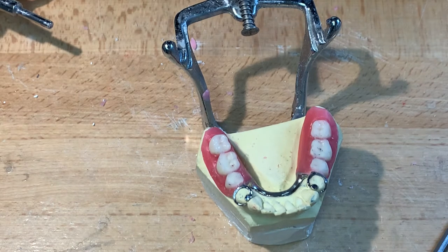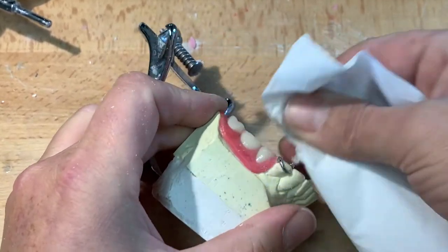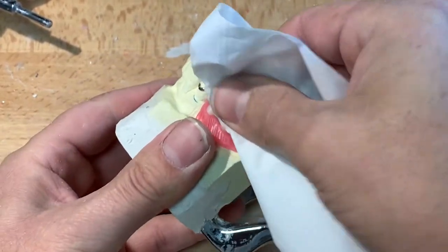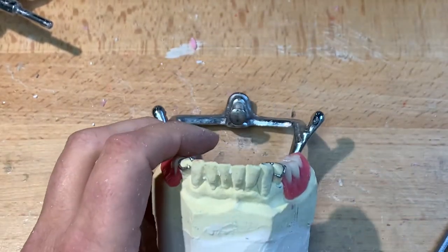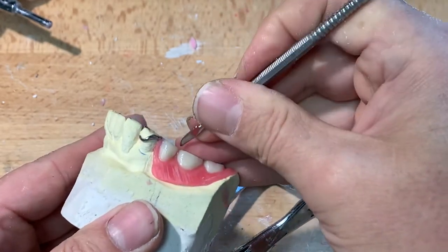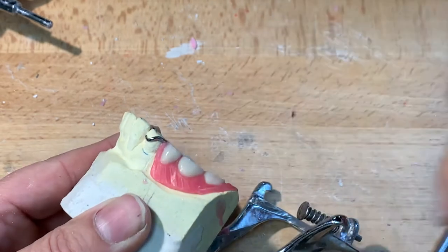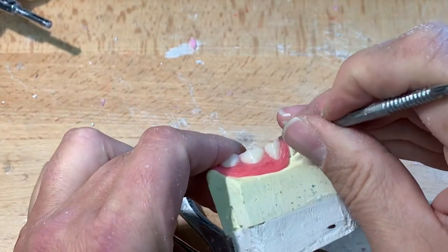Once we're satisfied with cleaning the wax off — the length of the gingival margins and the length of the flanges — we could go with a microscope or magnification to ensure there's no wax on the teeth. I'll take a little tissue with a dab of wax solvent. Be careful: don't use wax solvent on the flange, just on the teeth — just to take any kind of small film of wax off the teeth. I want these to be in their high luster as they were when they came off the card. I'm using a Zeal carver or something a little sharper to get the smaller details of wax interproximately, maybe redefining some margins.